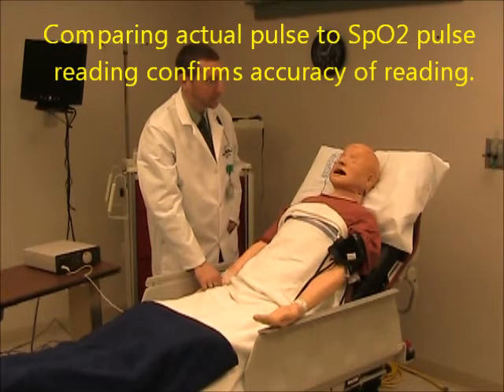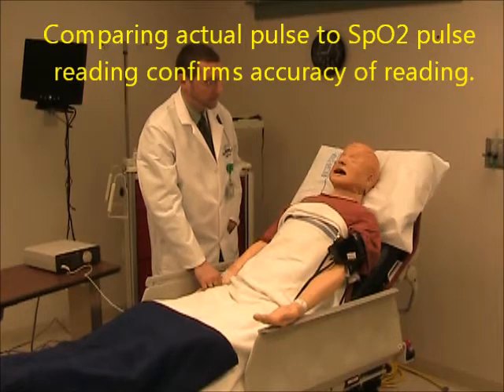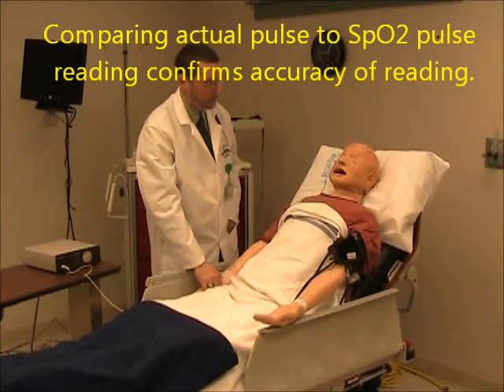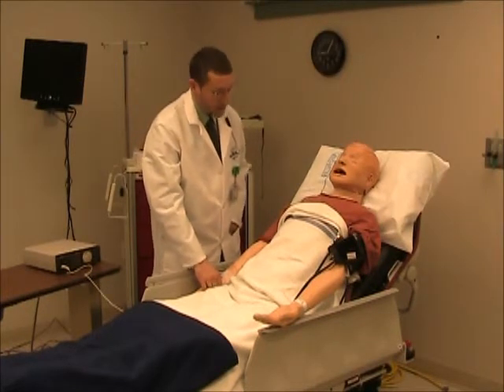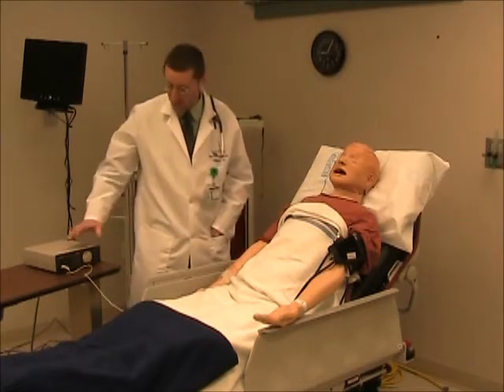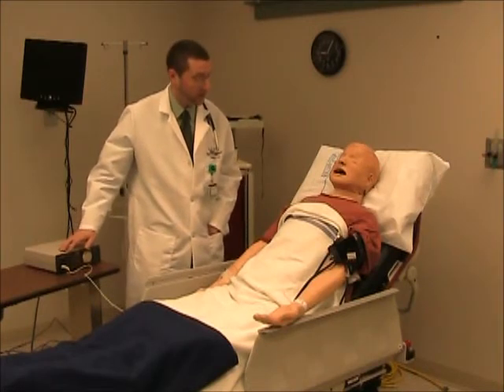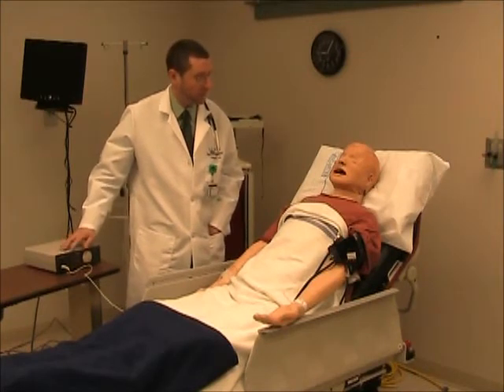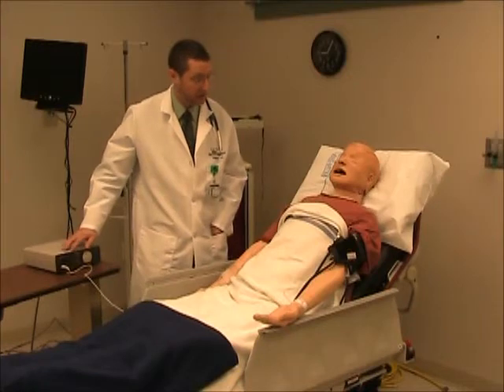Assesses vital signs, respirations, and SpO2. Looks like the machine is working correctly, your pulse is the same, so we're going to assume that your Oxygen concentration is just a little bit low.